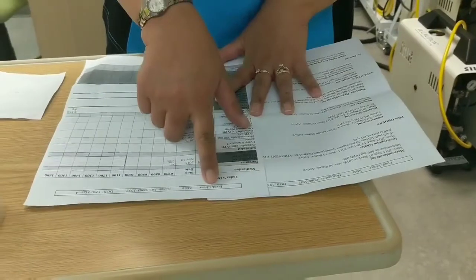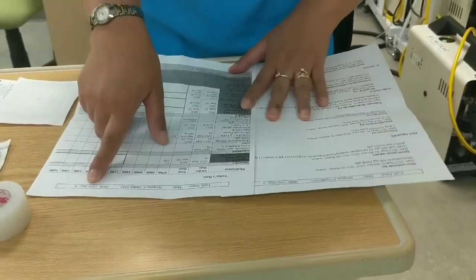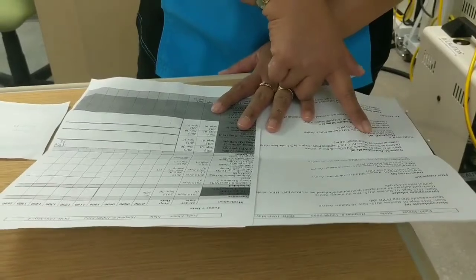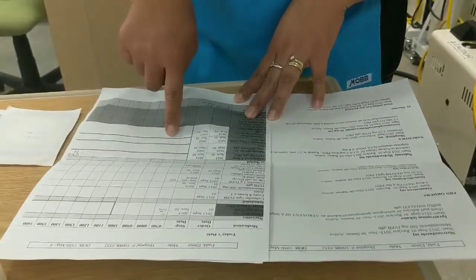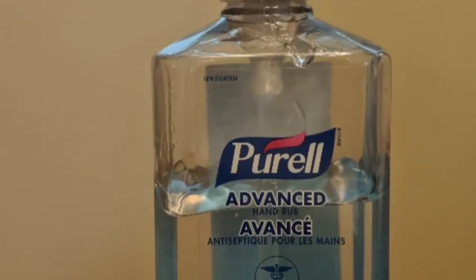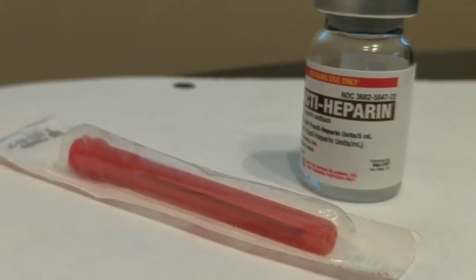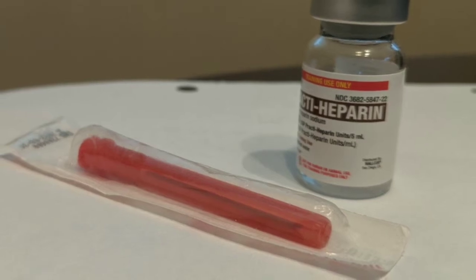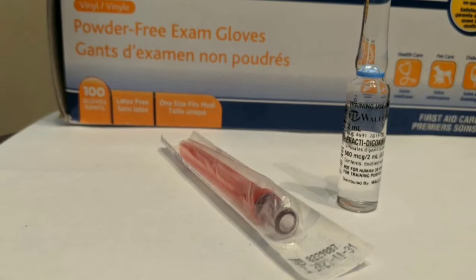Before giving any medication, you need to check the doctor's order and the MAR. After verifying the doctor's order and MAR, it's time to gather all the supplies that you need. You will need hand sanitizer, clean gloves, a blunt needle if you are going to aspirate the medication from the vial, and a filter needle for medication from ampules.